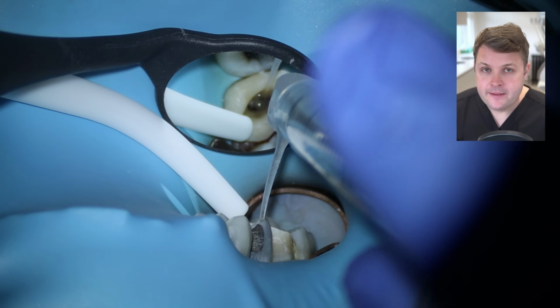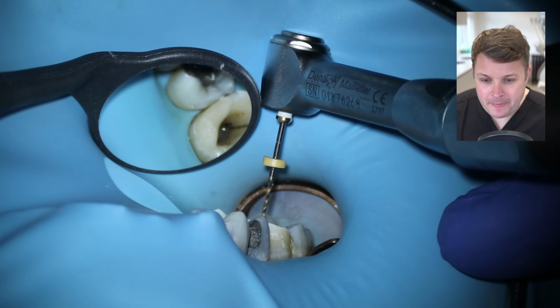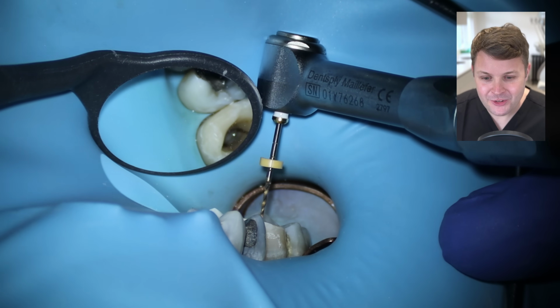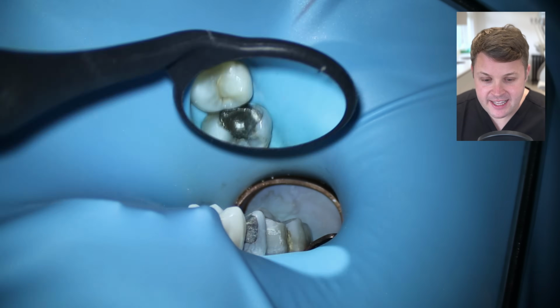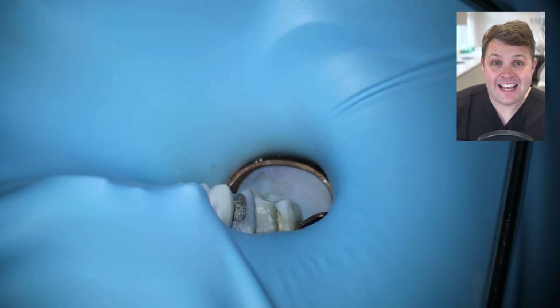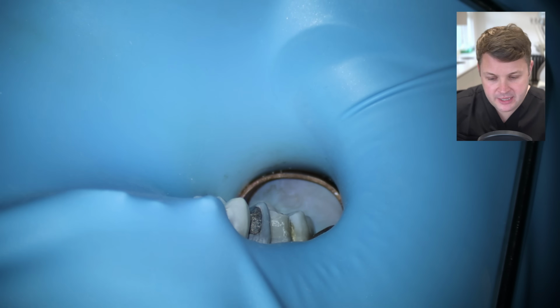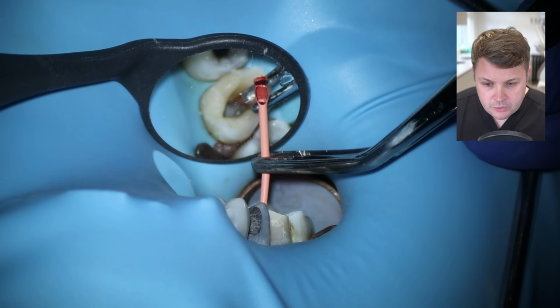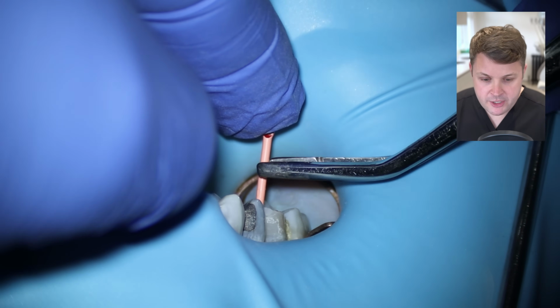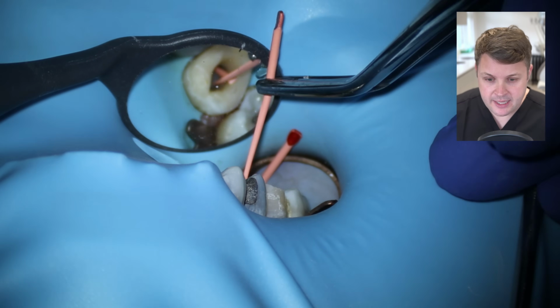Don't be scared to replace your rotary files. It'd be the worst thing to happen. You've spent all this time shaping the canals, and then you snap it on the final canal orifice. And I noticed that this glide path file goes really nice to length, and then what I do is I shape it to a size 20 and also a size 25, mainly because I feel like it's going really, really nice and easy to length. We're then ready for our cone fit radiograph. Of course, we need to do a cone fit radiograph to see that we've shaped it to length.